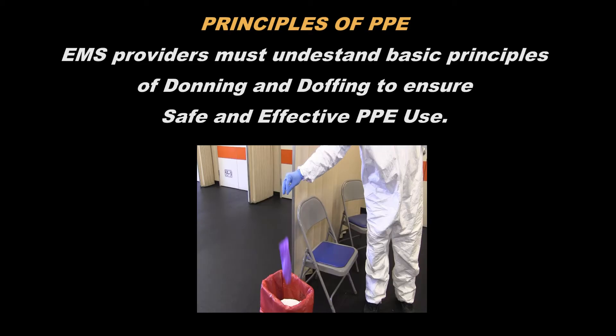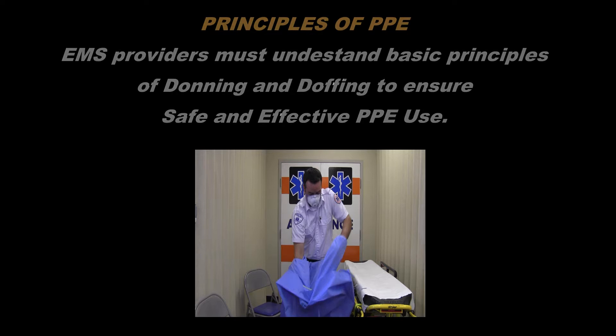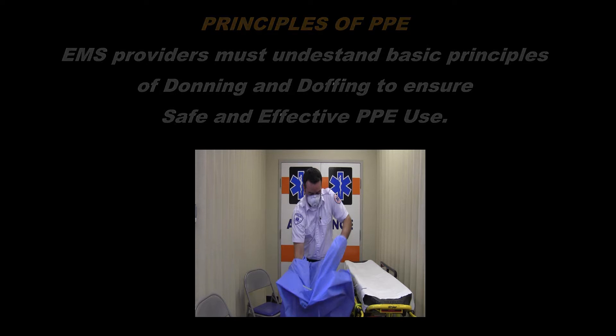After patient contact, it is very important to follow the correct removal or doffing procedures. The doffing of PPE is a high-risk process that requires a structured procedure and a trained observer, who again may be your partner. PPE must be removed slowly and deliberately in the correct sequence to reduce the possibility of self-contamination or other exposure to any infectious diseases.